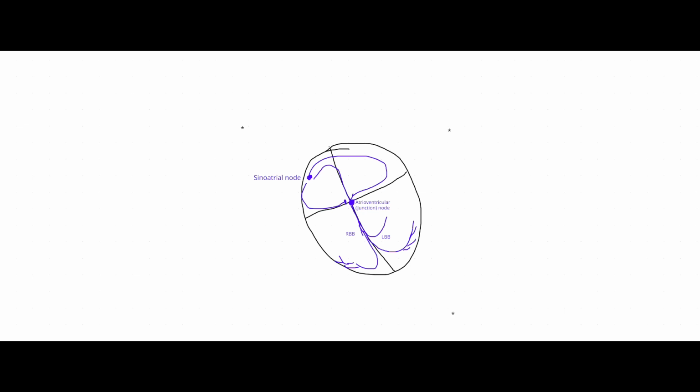So what are we actually measuring when we do this? So this up here measures lead 1. Okay, so it's not the 1 point, it's the 2 of them connecting that's capturing the energy up top into lead 1. Okay.